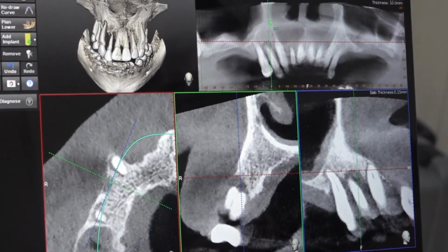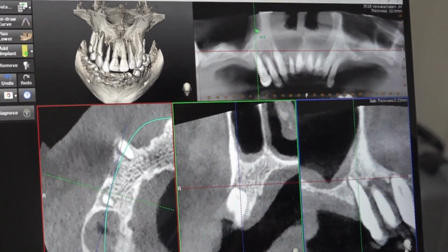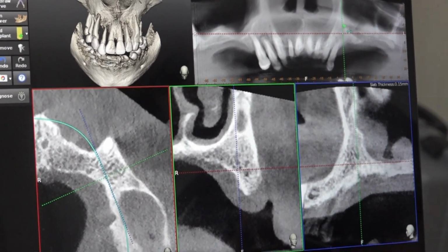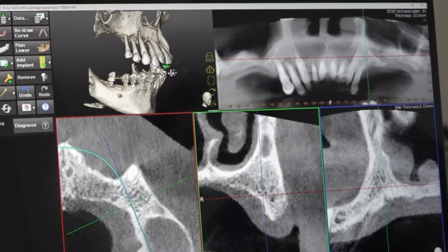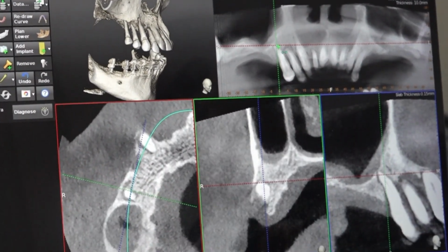Now the patient has come for upper. So this is the second premolar. So we have to see how many implants and what is the bone quality between premolar to premolar. Okay. So right side 2 premolars are present. We will start from the second premolar. Okay.